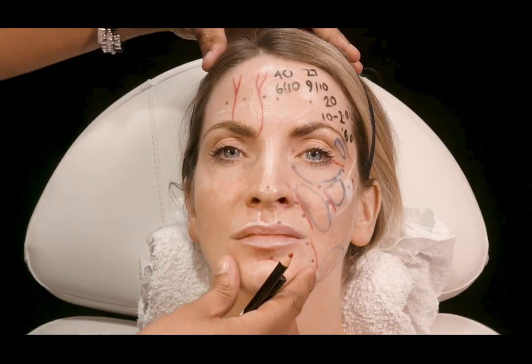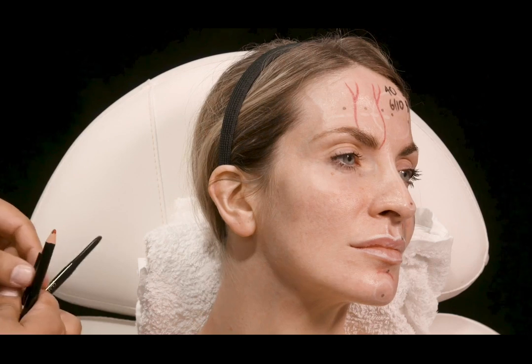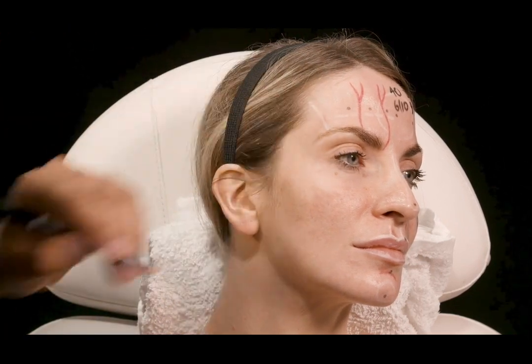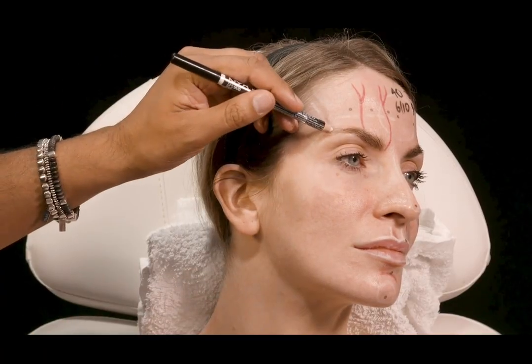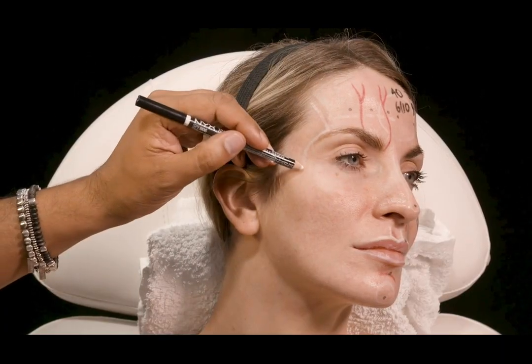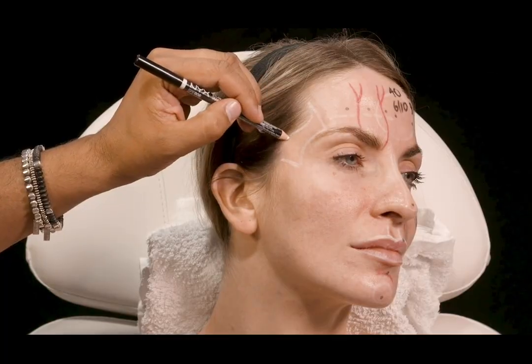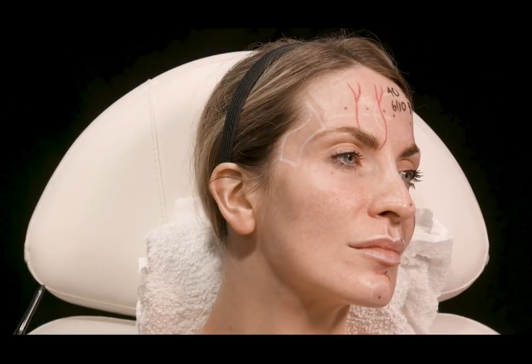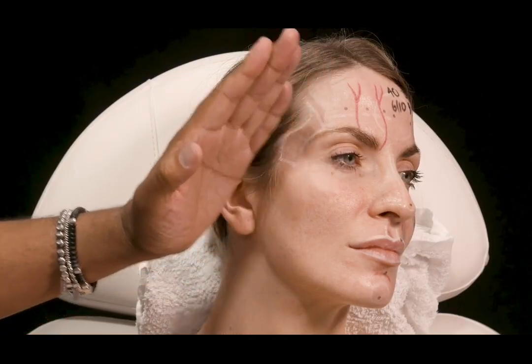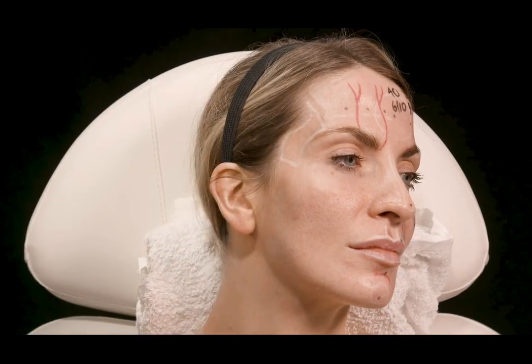Let's have a look at the temple. Temple should be really easy and safe. So I'm going to demarcate the superior border of the temporal fossa, the anterior limit, and also the inferior margin, which is the zygomatic arch, and really the hairline, which demarcates the posterior border. Now, this is the aesthetic temple. The anatomical temple goes all the way back into the hairline, but we don't want to treat this bit, we want to go here.